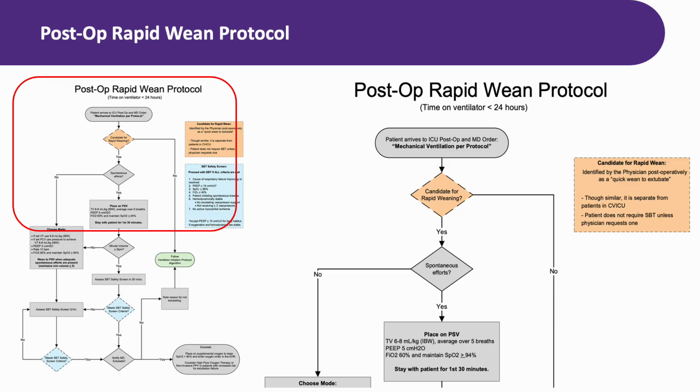If everything looks good at 30 minutes, you're ready for the next decision point in the algorithm, the extubation readiness assessment. For these post-op patients, we're assessing at the 30-minute mark. That is significantly faster than our standard SBT protocol because these patients have a fundamentally different clinical trajectory. They were breathing fine before surgery, and we expect them to breathe fine after surgery once the anesthesia wears off.